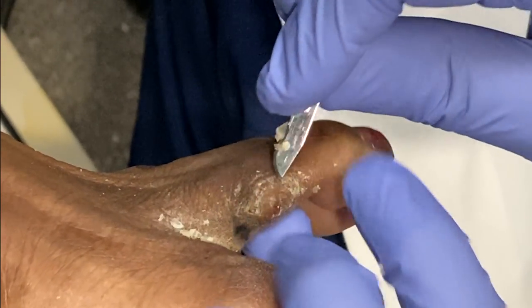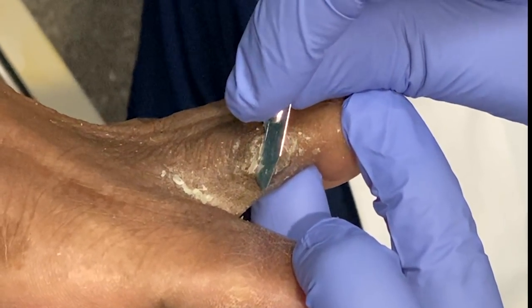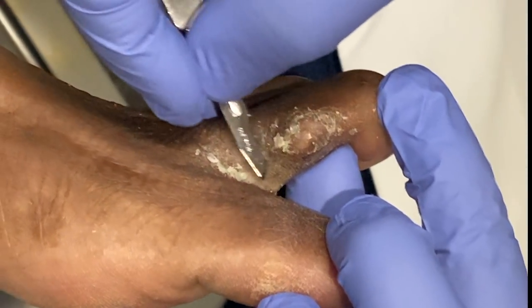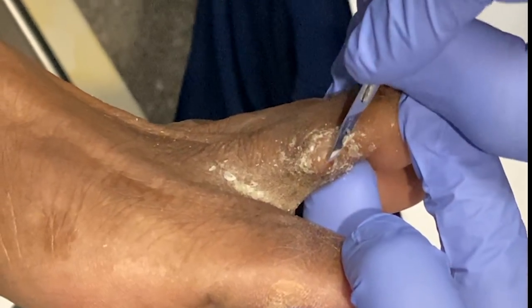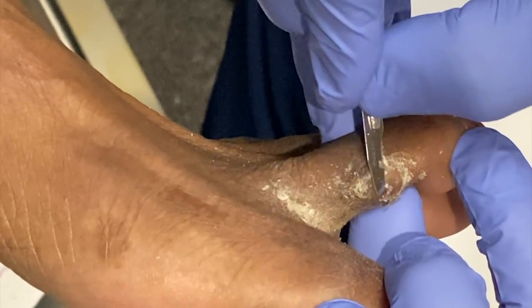This is the same type of blade I use in my open surgeries where I'm actually cutting through soft tissue. So I want to be very, very careful as I'm gently taking off layer by layer. Much easier to do it this way than trying to take it all off in one big chunk. The only time we were able to do that is in the beginning when you saw me use the actual nail nipper and remove a bit of that hard, hard top layer.